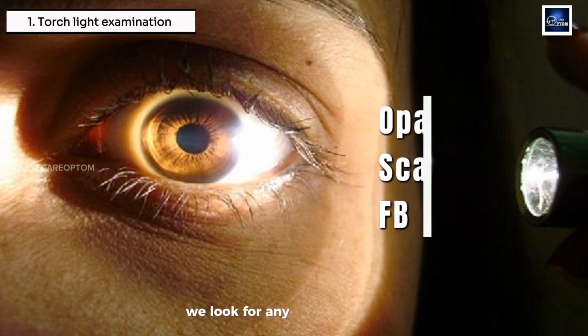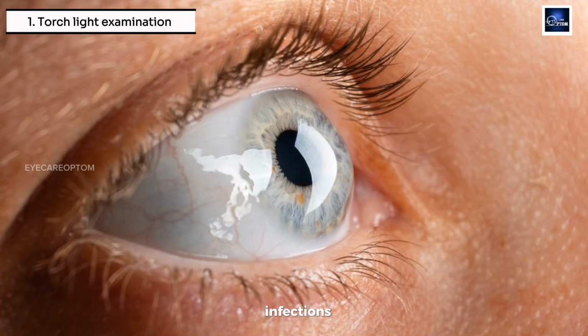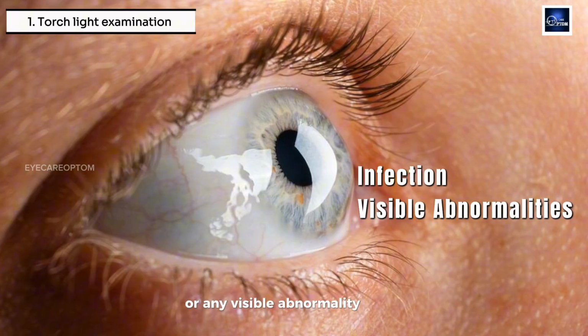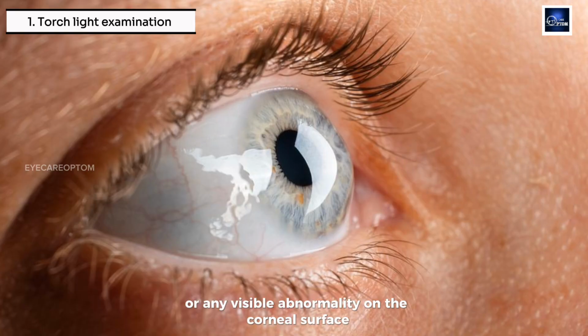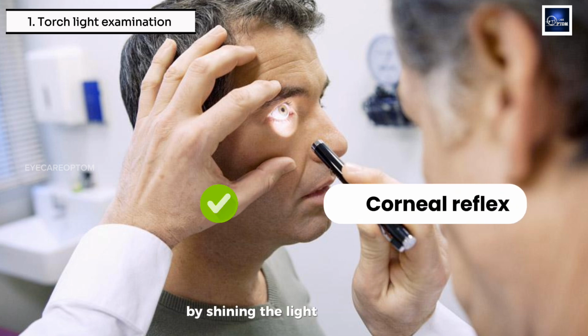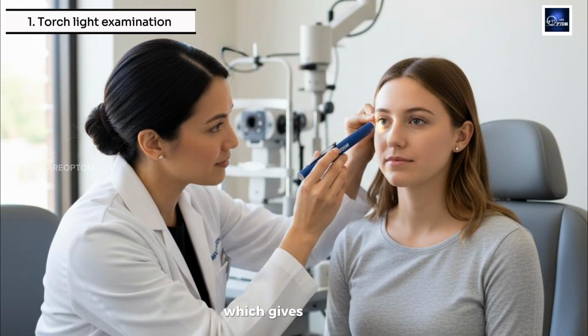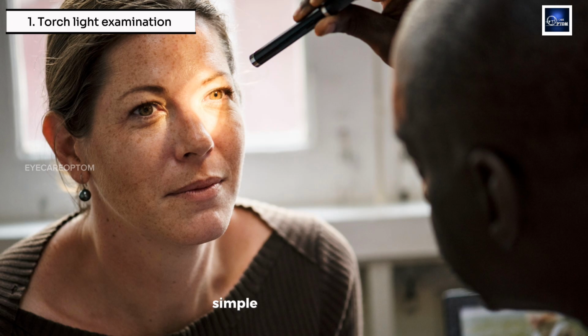We look for any obvious opacities, scarring, foreign bodies, infections, or any visible abnormality on the corneal surface. We also check the corneal reflex by shining the light at the cornea and observing where the reflection falls, which gives us a basic idea of corneal shape and asymmetry. Simple, fast, and available everywhere. This is always the first step.